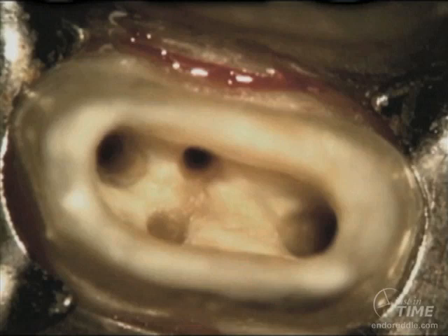The axial walls need to be flared back so we can get straight line access. So use the mouth mirror trick and you'll find that your access cavities will expand somewhat. By expanding your access cavities, you're going to have greater success in all your future endodontic endeavors.